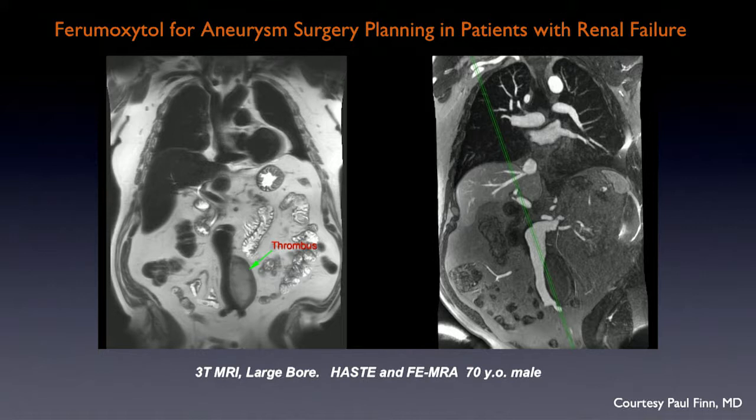Many patients who are being considered candidates for TAVI do have some degree of renal insufficiency, and so this is a way to save that iodinated contrast for the catheters, for the actual TAVI procedure if they need to confirm their location prior to placement of the valve.